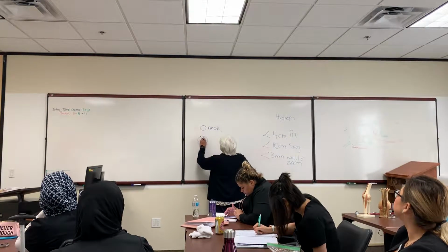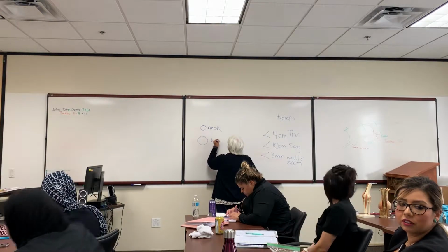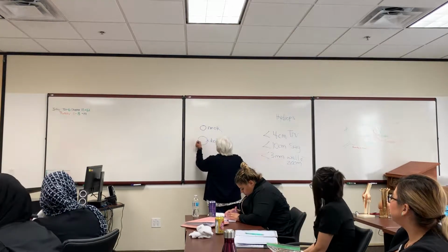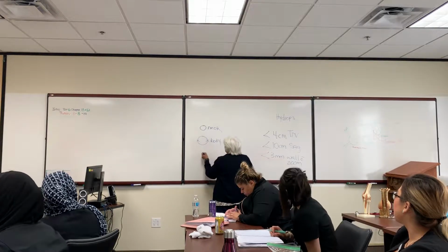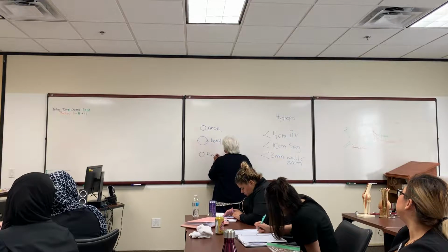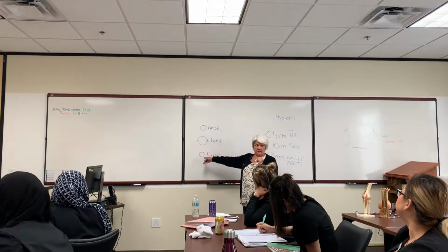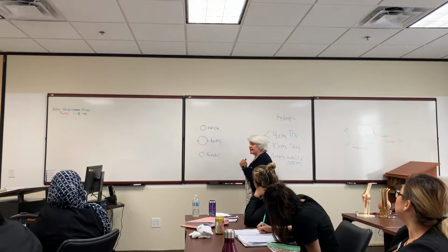Here is going to be my body, with and without measurements, okay? And then this is gonna be my fundus. That's exactly what it looks like. Just round, anechoic. Anechoic.